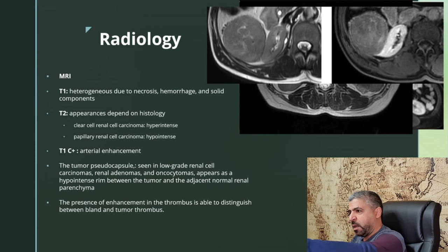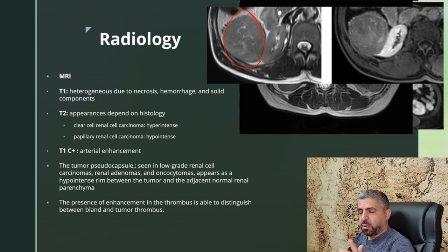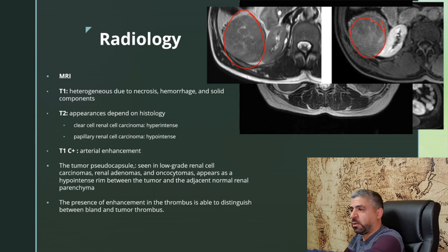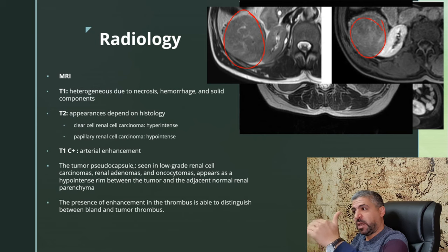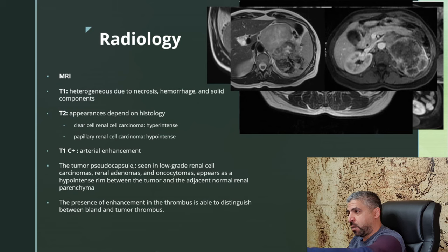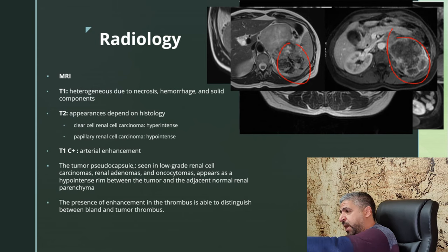In another case, the T2-weighted image shows an iso-intense tumor, so we cannot determine the subtype confidently. After contrast enhancement, delayed venous phase imaging shows relatively mild heterogeneous post-contrast enhancement washout, emphasizing the importance of the arterial phase. The tumor pseudocapsule is also visible here. In a large renal cell carcinoma replacing almost the entire kidney, the lesion is heterogeneously hypo- and hyperintense on T2 with heterogeneous post-contrast enhancement and areas of central necrosis.